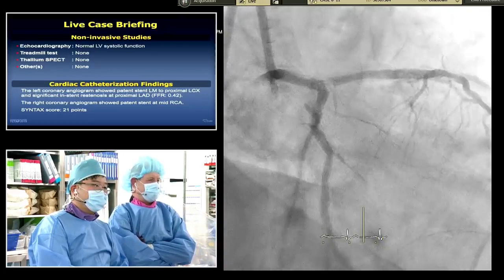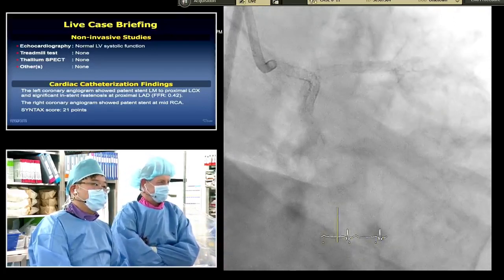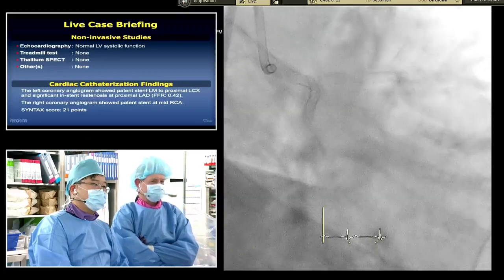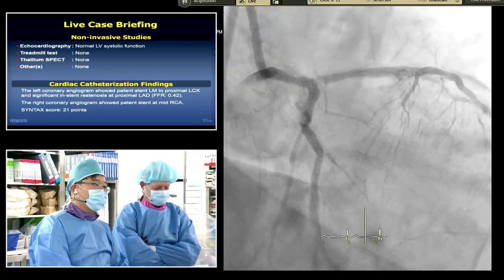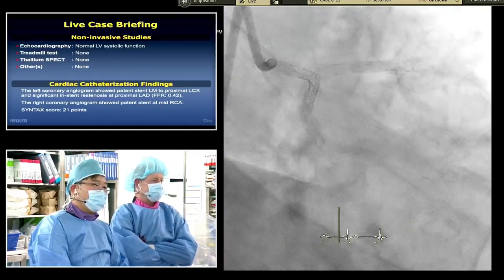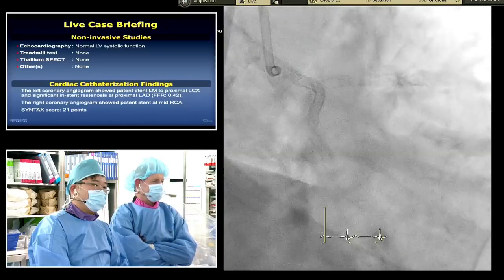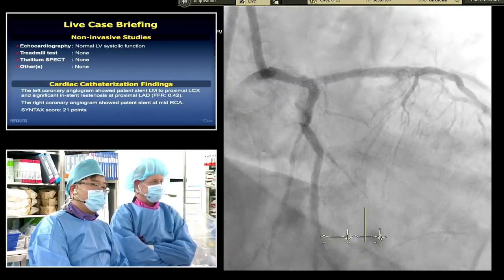So there's a lot of stent in that distal main. Sorry, I have a comment, Yves Louvard. I see the double layer coming from left main to circumflex. Okay. And the other stent in the LAD, and my impression is that the left main was not big enough with the stents.